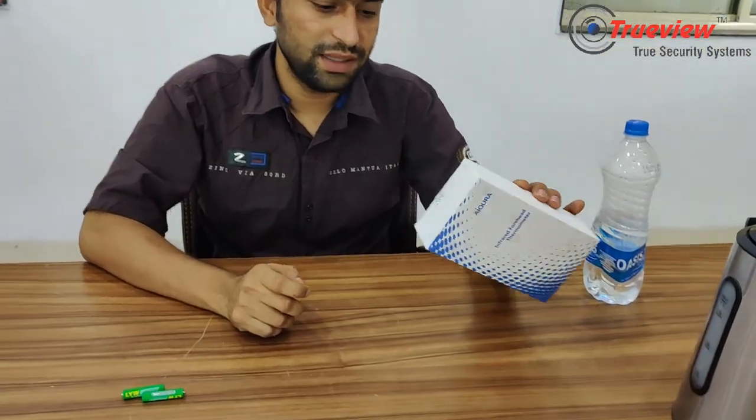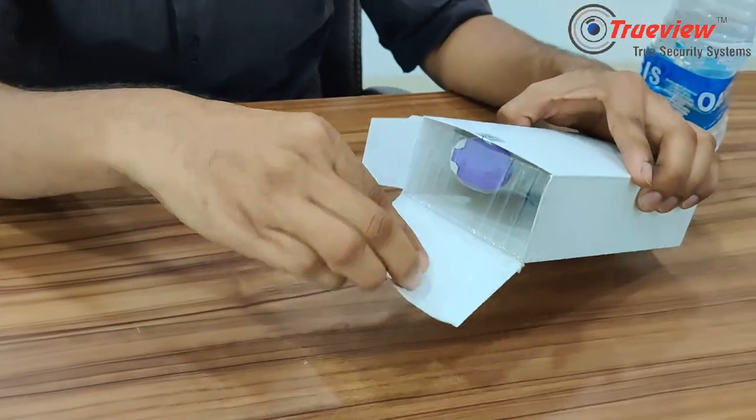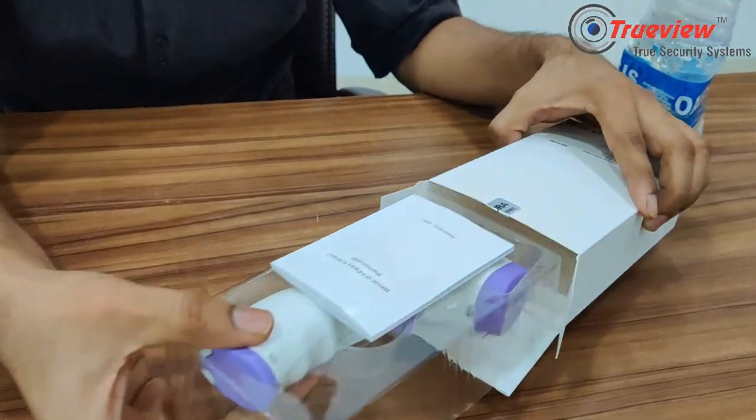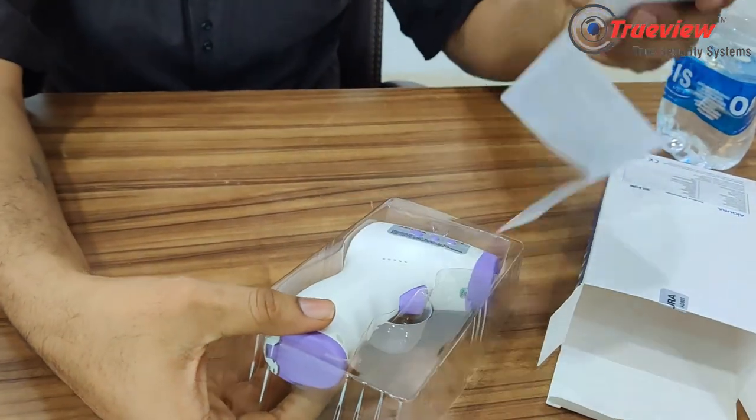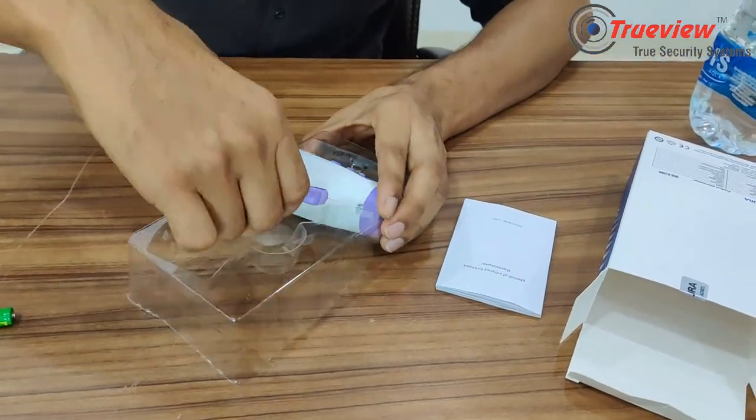There is a new piece here. First of all, let's open it and see what the contents are. Look, there is a user manual and a thermometer. Before using it, please read the user manual.